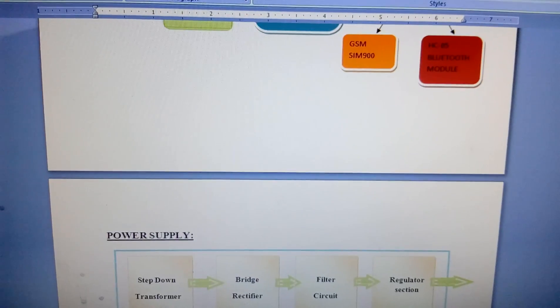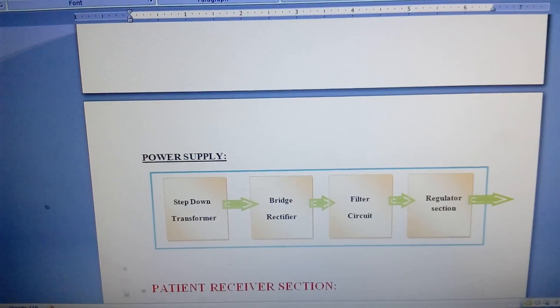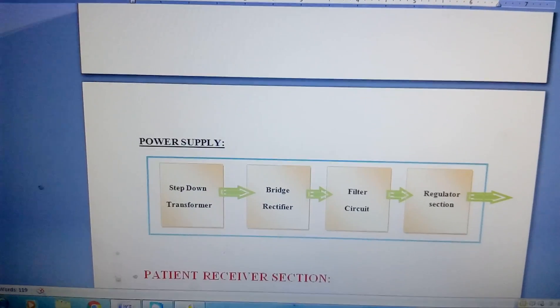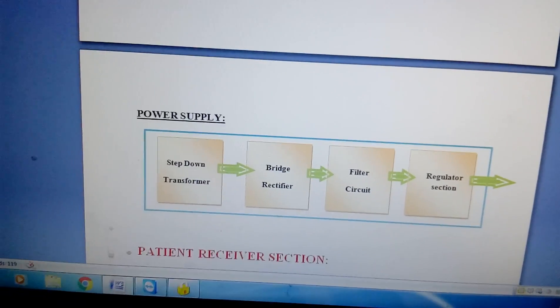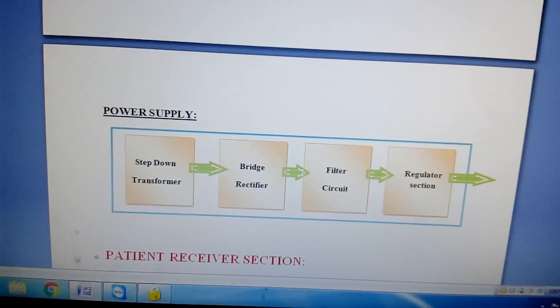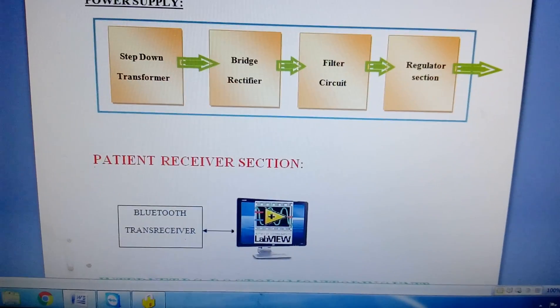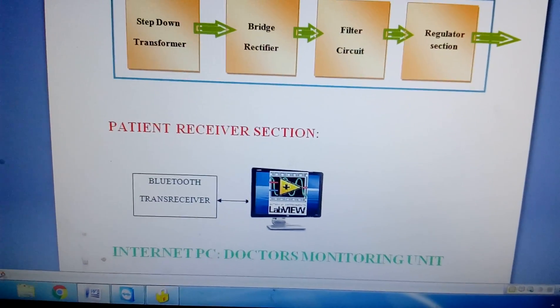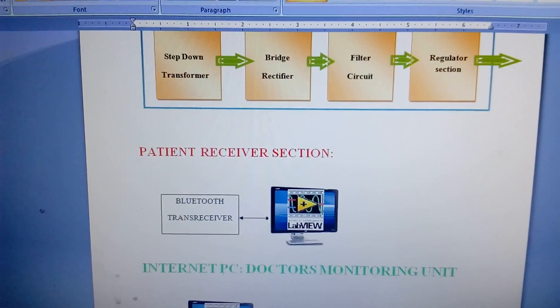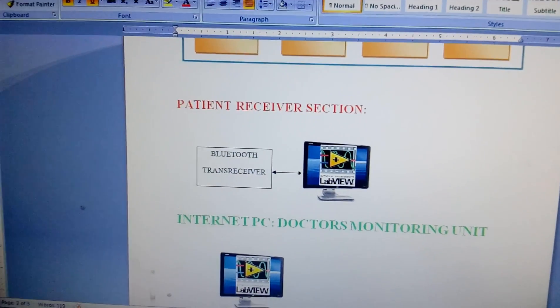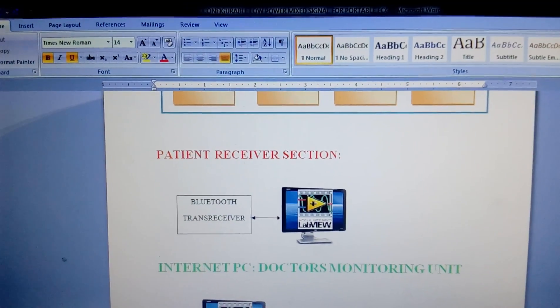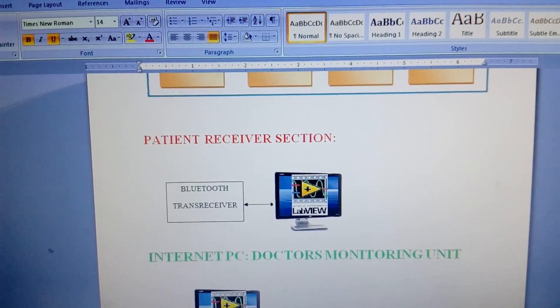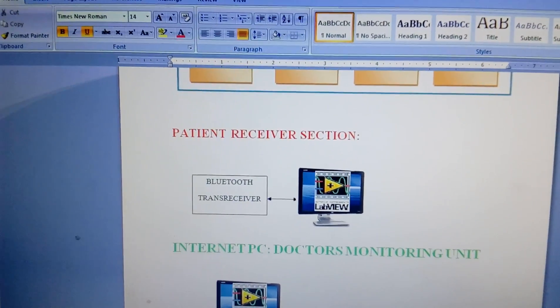Here I am using one power source regulator power supply, step down transformer, bridge rectifier, filter capacitor and one LM7805 regulator. We have two parts: one is patient monitoring unit and one is doctor's monitoring unit. Patient monitoring unit is connected with Bluetooth dongle or internal Bluetooth of the laptop.